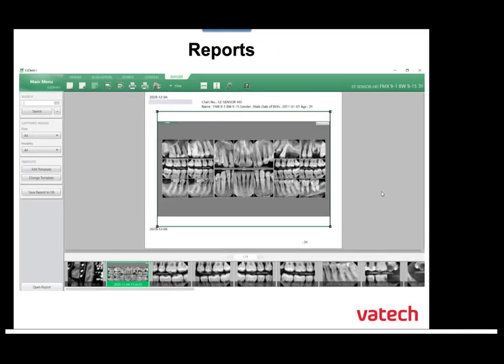I know this is a hot topic. This is the handoff from the assistants in hygiene to the front desk, or maybe the doctor, or whoever's doing our reports to send. Maybe you're a general dentist sending these off to the oral surgeon, to an ortho office, or even to insurance. We need to get these mounts and custom reports looking good. We want to have clean, accurate images, and really everyone has a different layout that they like.